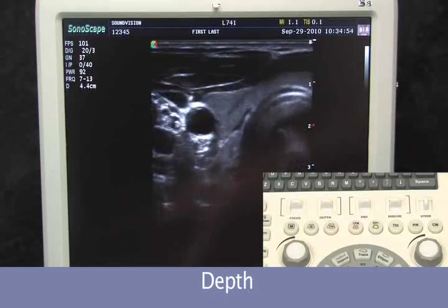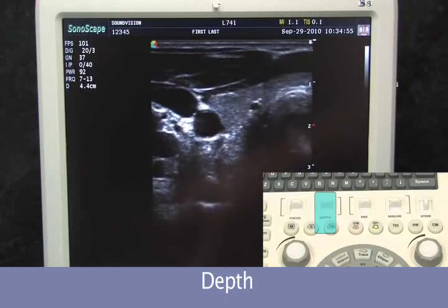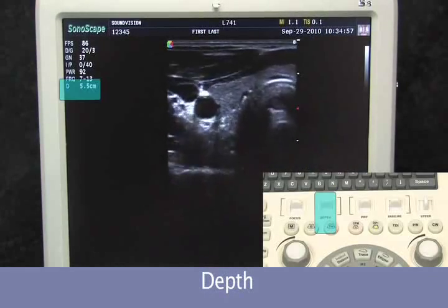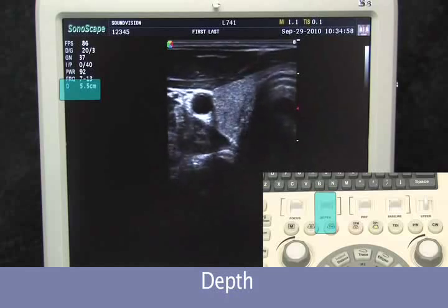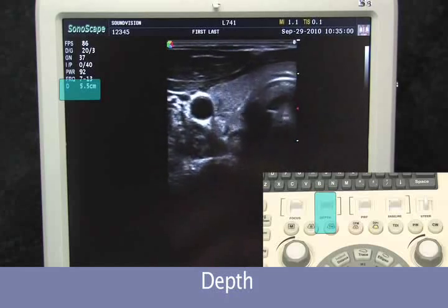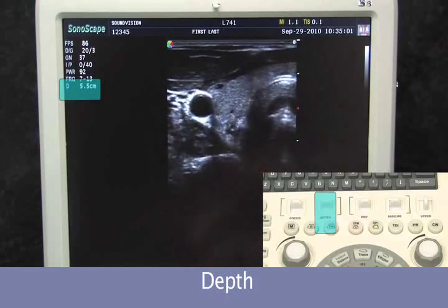To increase our depth, we are going to pull down to go deeper. To decrease, push up to go shallower.